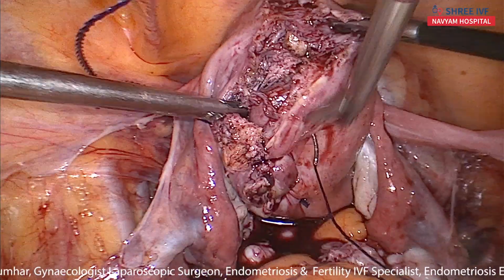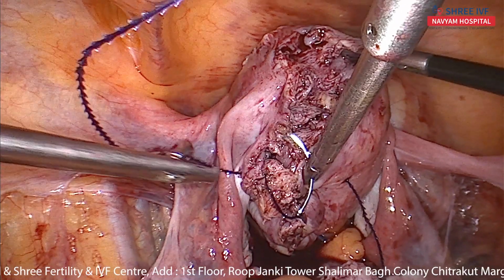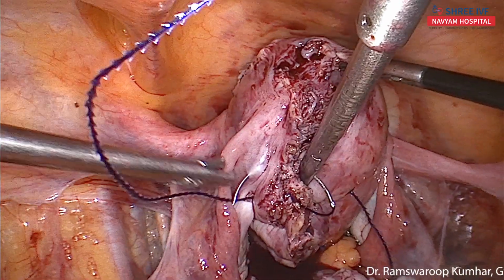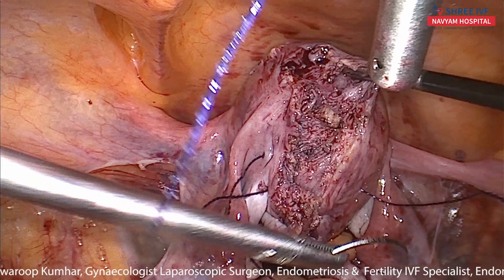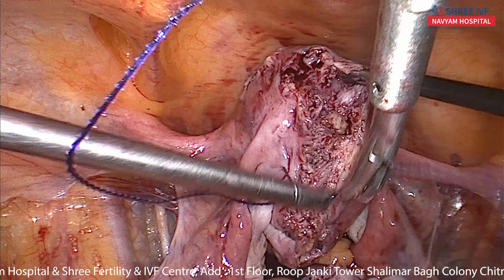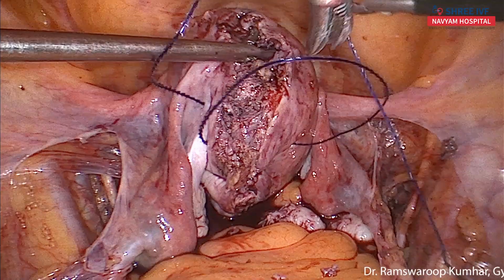Now trying to take suture one by one because simultaneously it is much more difficult. I am trying to preserve the fallopian tube. Remove this suture out.